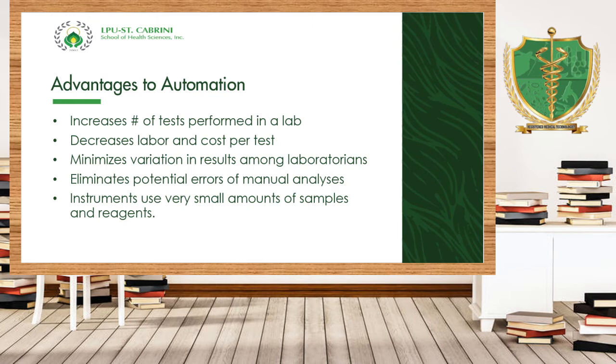Next, it eliminates potential errors of manual analysis, so I will not go deeper on that. It's self-explanatory. Then we have here that instruments use very small amounts of samples and reagents. Unlike in the manual one, where you need 1 ml or 0.5 ml of sample. If you only have 1 ml of the serum, we have to conserve it, especially if you have to perform a lot of tests.